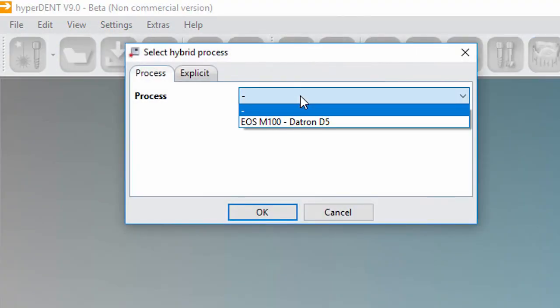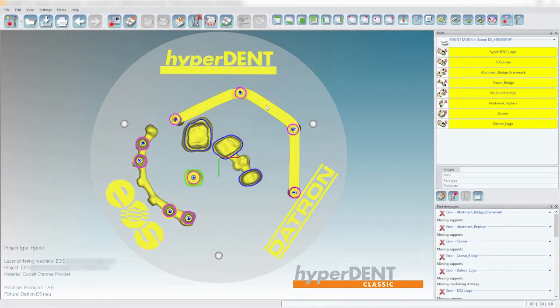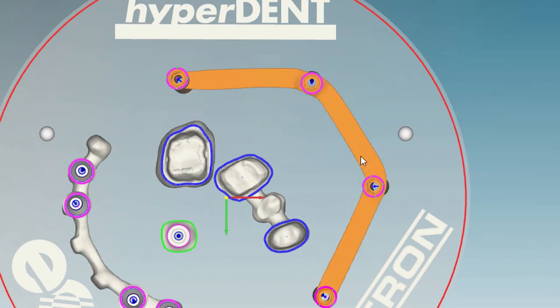Choose the machine combination of your choice. Afterwards, file import parts are nested automatically. You can also nest your parts manually.